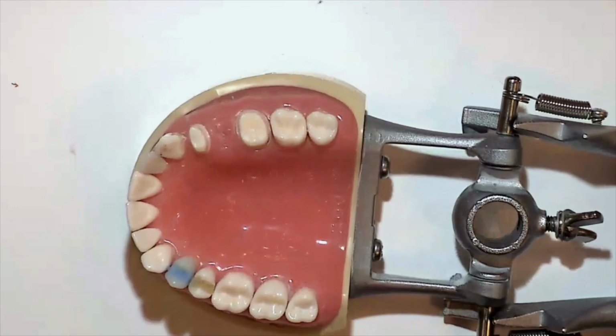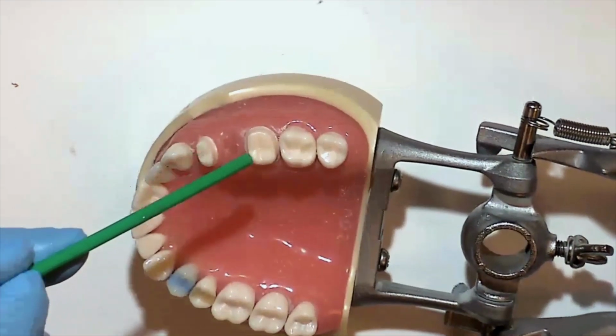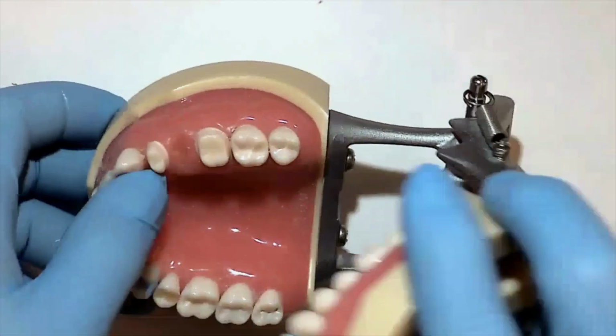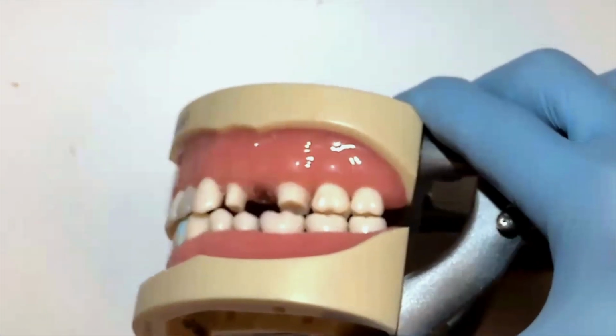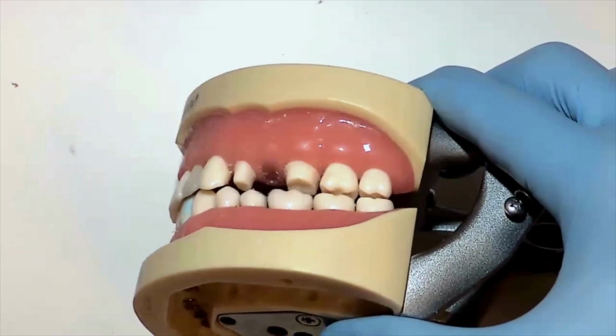Here we have our maxillary model showing our prepared teeth on the upper, number 12 and 14, and a pontic for 13. You can see we have enough occlusal clearance for the thickness of the acrylic, and when we make this temporary, we will be guiding it with a canine guidance and trying to pick up some group function at the same time.